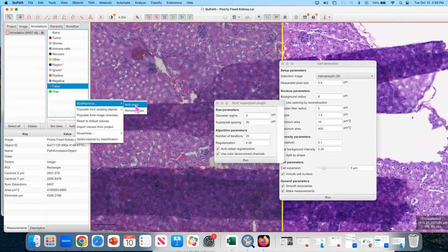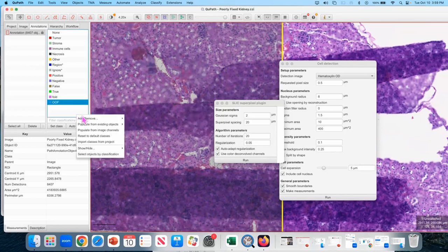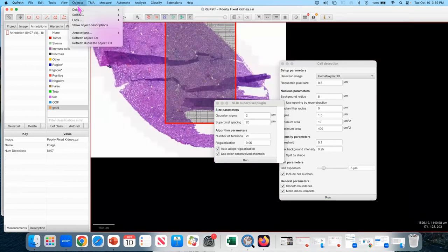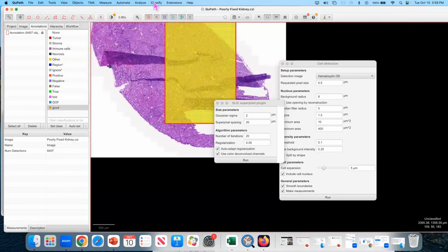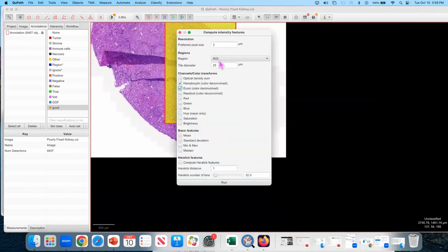So I'm going to add a couple of classes called fold, called out of focus, and called good. One thing, superpixels don't by default come with measurements. So we're going to select all detections. Features, add intensity features, this. I'm going to do this.